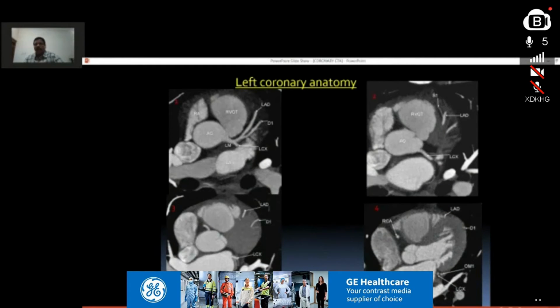Now, before we set in with our 3Ds and scan evaluation, it is always a good idea to look at the coronary arteries on an axial image. You can MIP them, but the key point is do not MIP your images more than the vessel wall diameter. So a typical coronary artery is around 2 to 3 mm, and these are 0.5 millimeter scans. So you should always MIP say around 1 or 1.5 if you want to see the scan quality or the image anatomy.